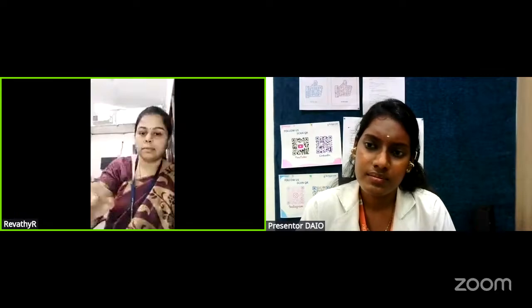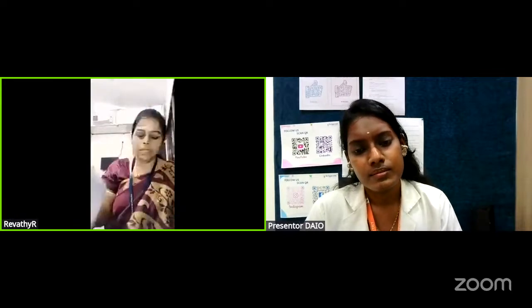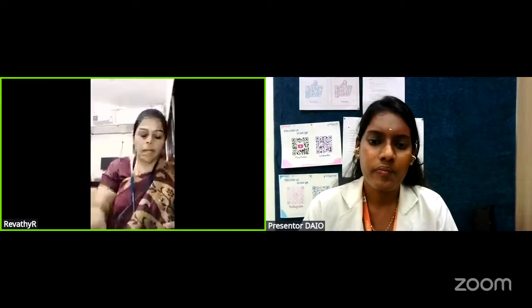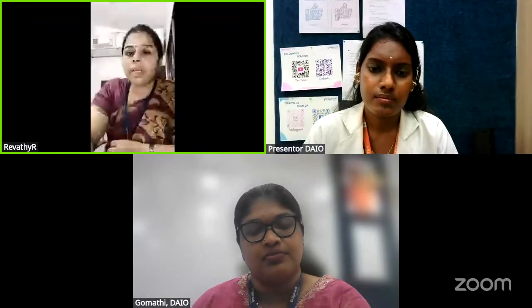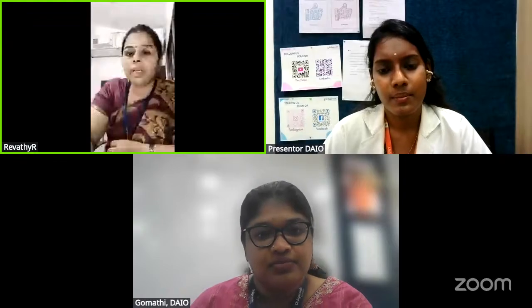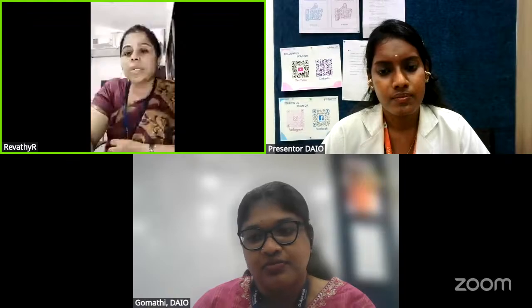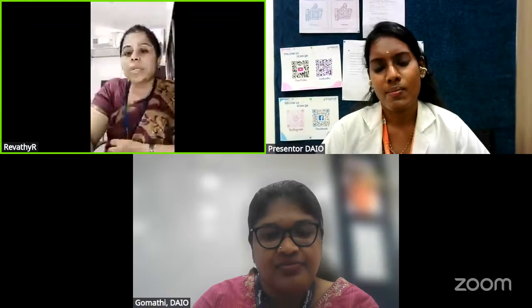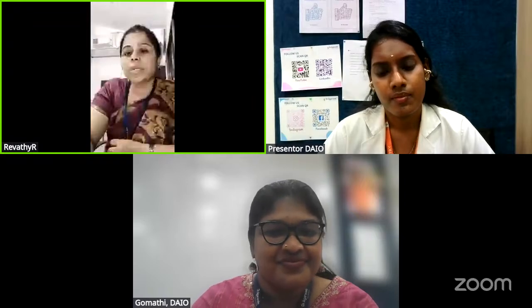So these are some of the points I wanted to add. Don't ignore dry eye, it is one key point whenever you do keratometry. Proper, periodical calibration is very important. Precision is important. Whenever you have a doubt, you can recheck your values with somebody who is also good at performing keratometry. Good training, and keeping up with the training, is important to ensure getting a precise keratometry value. Okay, so that's all.